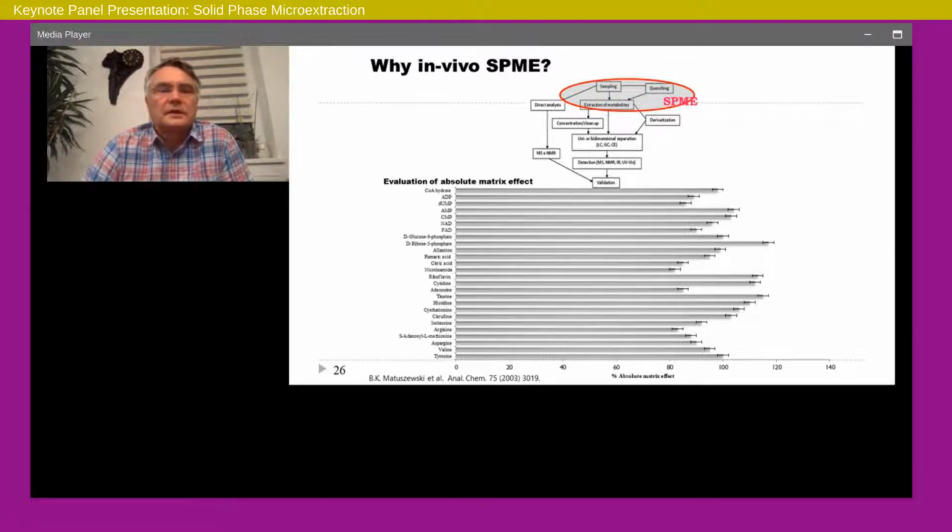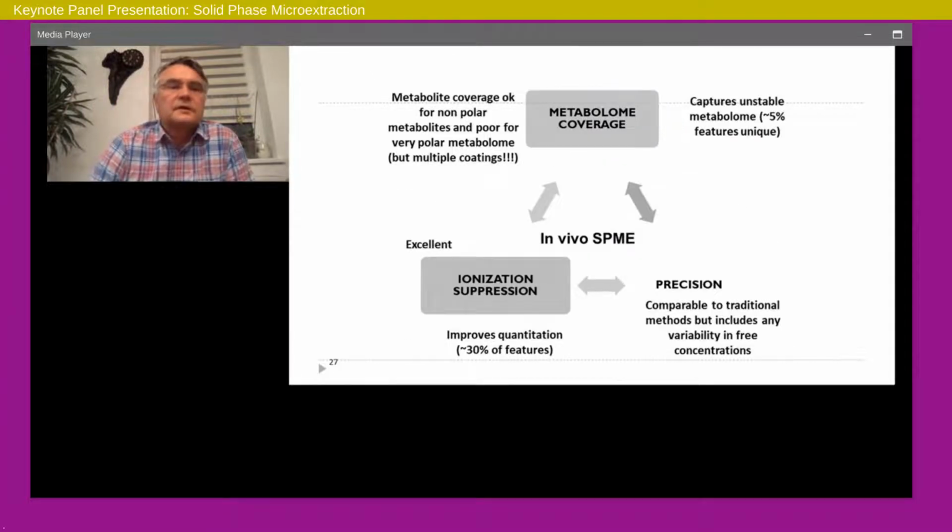And again, the beauty of it is that when you remove this chemistry, you also isolate it from the enzymes, and therefore there's no enzymatic degradation of the sample. So you combine it: the extraction quenches automatically, and there's no matrix effect. So it's a very effective tool.